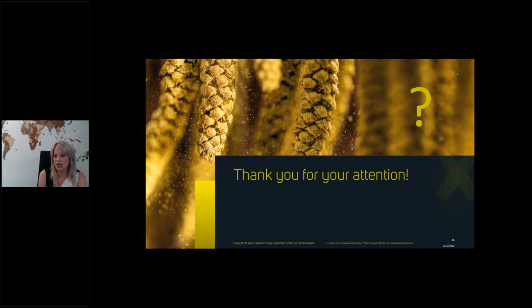Here we also give reference values for certain allergens, but of course you could also use serum samples that you have in high quantities to always run with your test systems or with your runs. Okay, great, thank you.